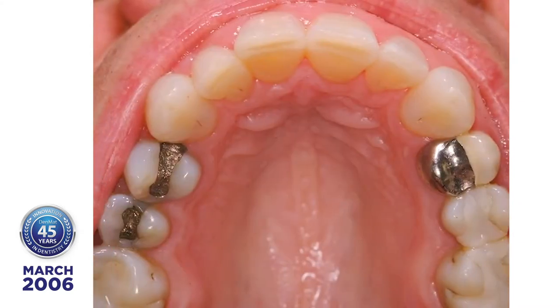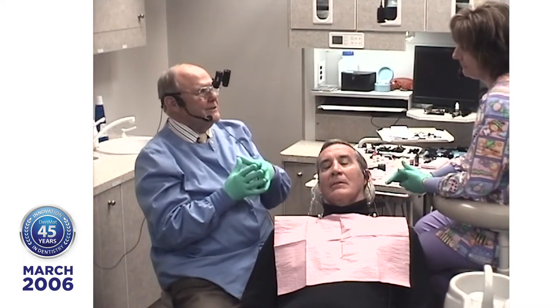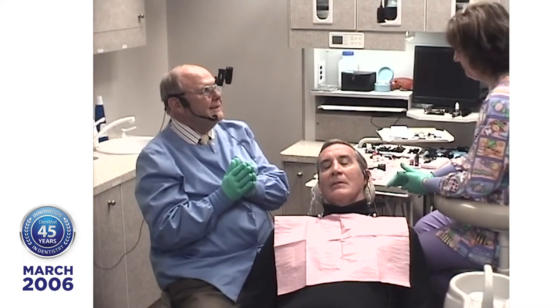Total, we got 18 pieces of porcelain here. So this is a real leap for me. The most I've ever done at one time is 10. But once we get rolling, you'll see it doesn't take that much longer. It takes almost as long to do one as it does to do 10. Especially if you're doing one over.